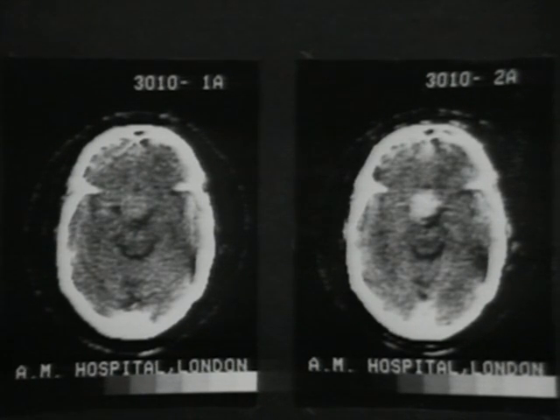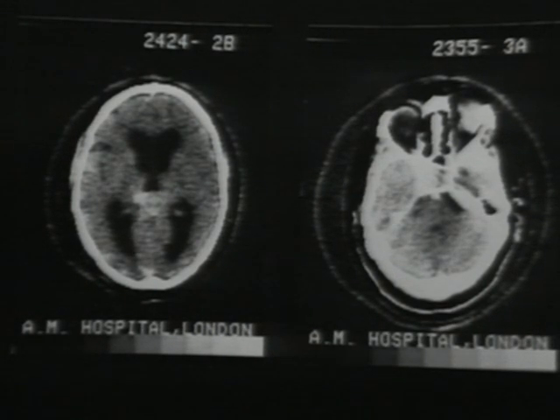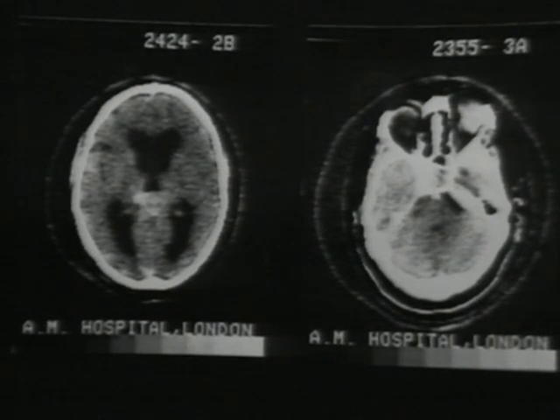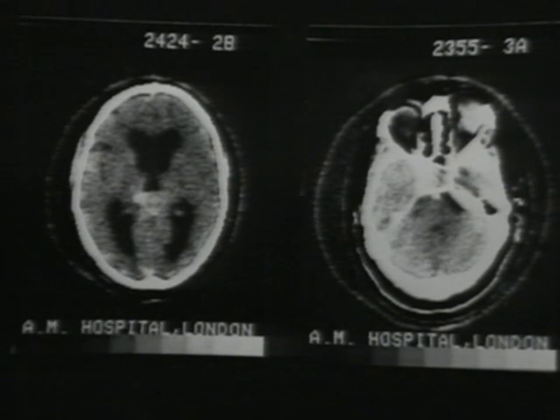When we come to the tectal plate area, this may also be examined in some detail. Tumors arising in this area will cause an obstruction. The lateral ventricles will enlarge and the third ventricle will become widened. The tumor itself may be partly calcified, in which case it's a pinealoma, or some sort of tumor which arises in the tectal plate area.